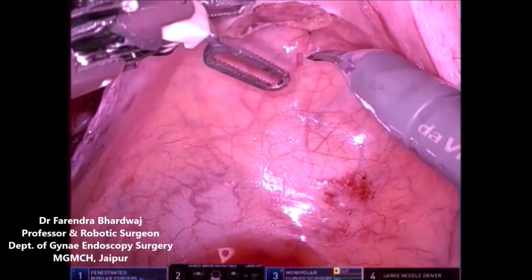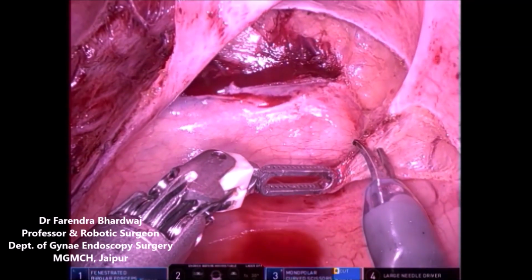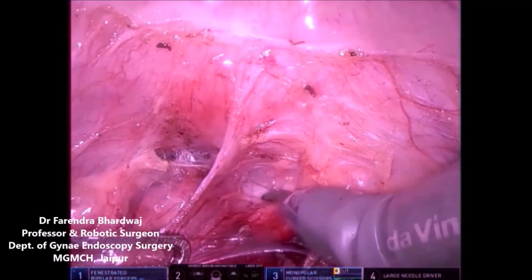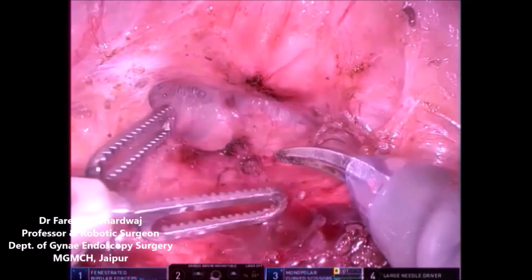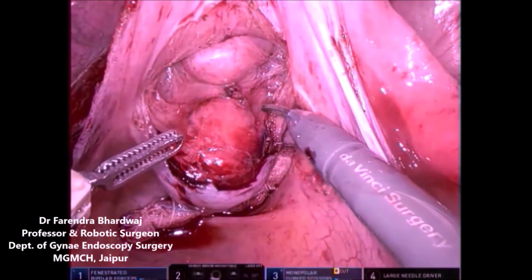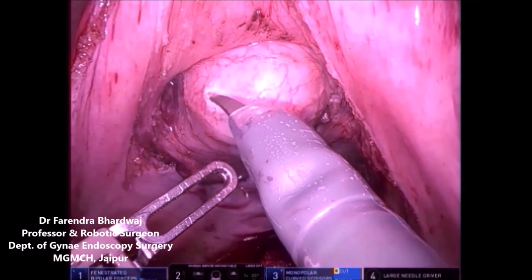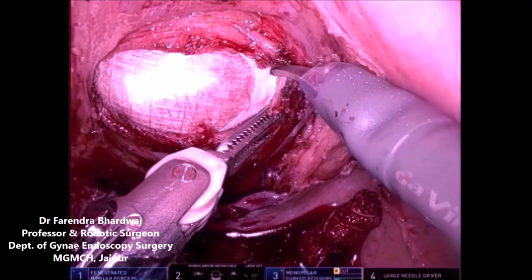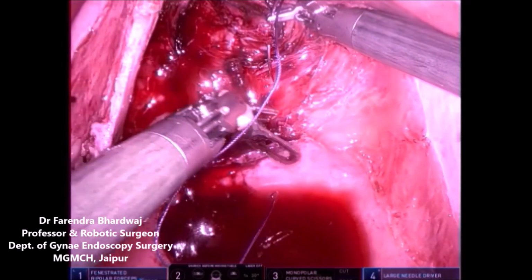Now the posterior dissection is carried out to dissect the rectum down so that the area between the rectum and the urogenital sinus is exposed. Now a rectal probe was inserted in the rectum and a sponge on holder was pushing the dimple into the peritoneal cavity, over which the vaginal opening was created.